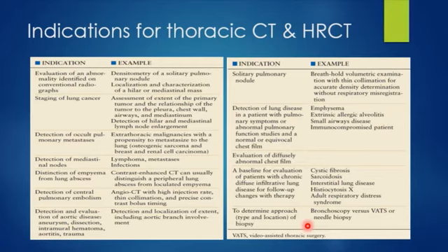It's reconstructed using a high-resolution bone algorithm. So why don't we do it for everyone with the high-resolution bone algorithm? Because it's high resolution, we could do it for every case. Why don't we? Because high resolution means more details and more noise. So first, we'll have a higher noise level. Second, if you do it in every patient, you need to do it continuously, and if you do it continuously, we'll have a very large radiation dose. So it's indicated only for diffuse parenchymal lung disease, and it is without contrast. Always without contrast. Thank you.